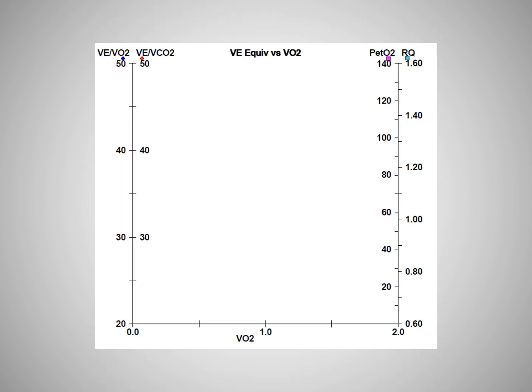I recommend picking 4 variables that change their shape or slope at the point of AT, and plot them on 4 different y-axes. First, we're going to look at a breath-by-breath plot of the VE to VO2, or ventilatory equivalence for oxygen. I've created artificial patient curves to make my points a little clearer, but then I will show you actual tracings of patients to better correlate this information.